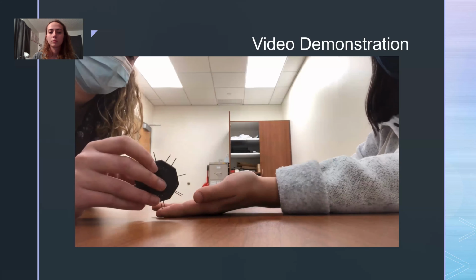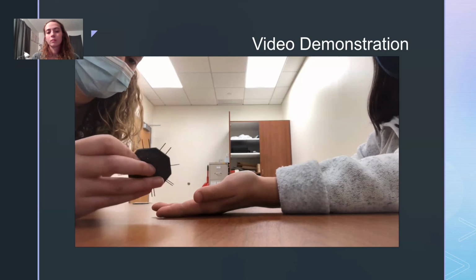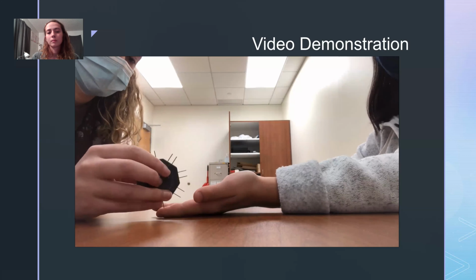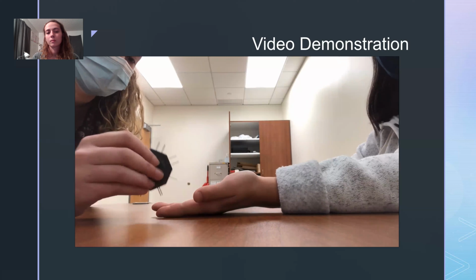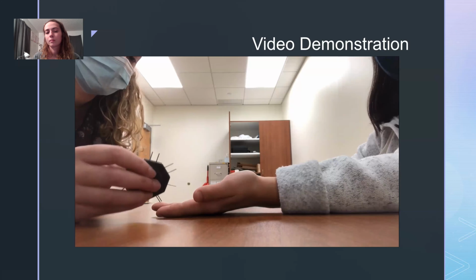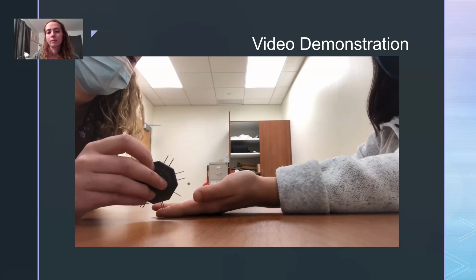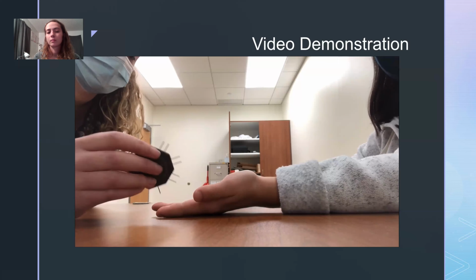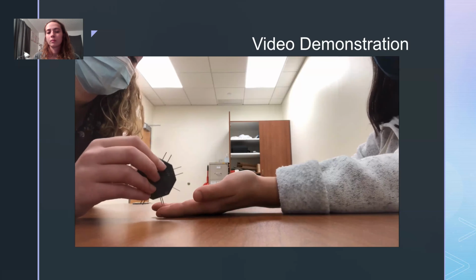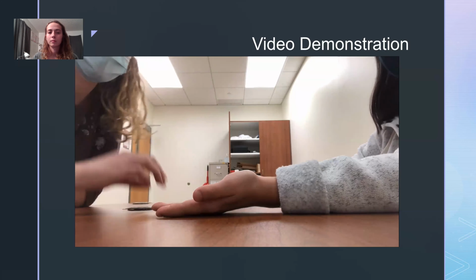In the beginning of the video, I explained the purpose of the test on Alina's non-affected hand. For the purpose of the angle of the video, I continued testing on her non-affected hand, but in real life, the therapist would have switched to her affected hand as this is such a specific test. Alina continually got 7 out of 10 correct, so I continued to decrease the distance for the static test. Based on her performance, it would be documented that Alina got 7 out of 10 responses correct with a 2 millimeter distance, indicating normal 2-point static discrimination.